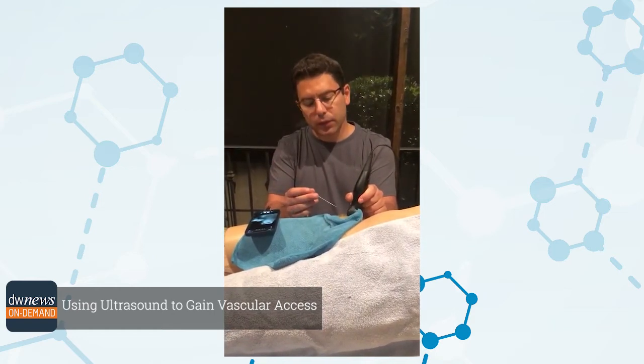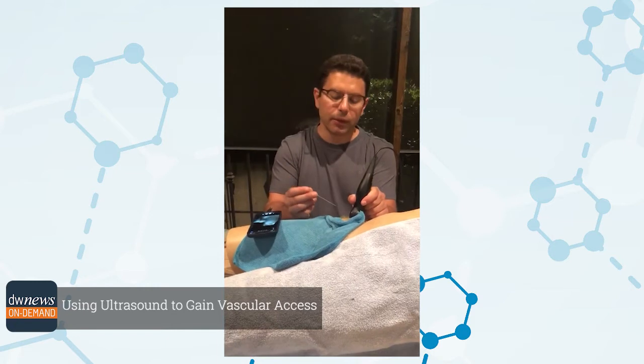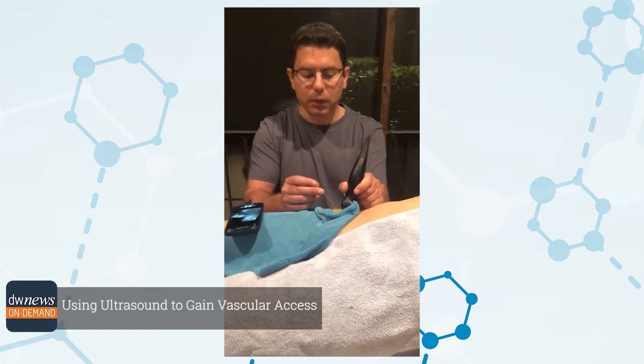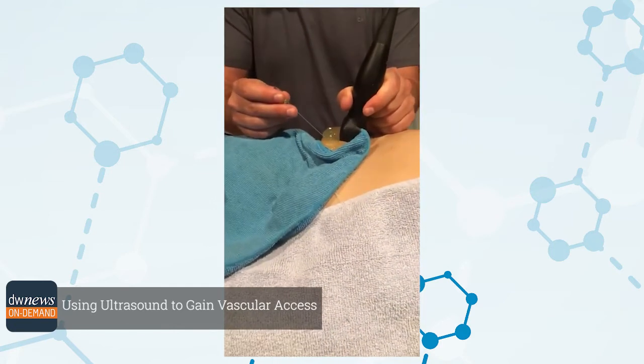I actually ultrasound almost at a 90-degree angle with a slight tilt. And obviously the angle of entry into the artery has to be close to 45 degrees. We don't want to start right next to the ultrasound imaging site — we're going to start a little bit more proximal.